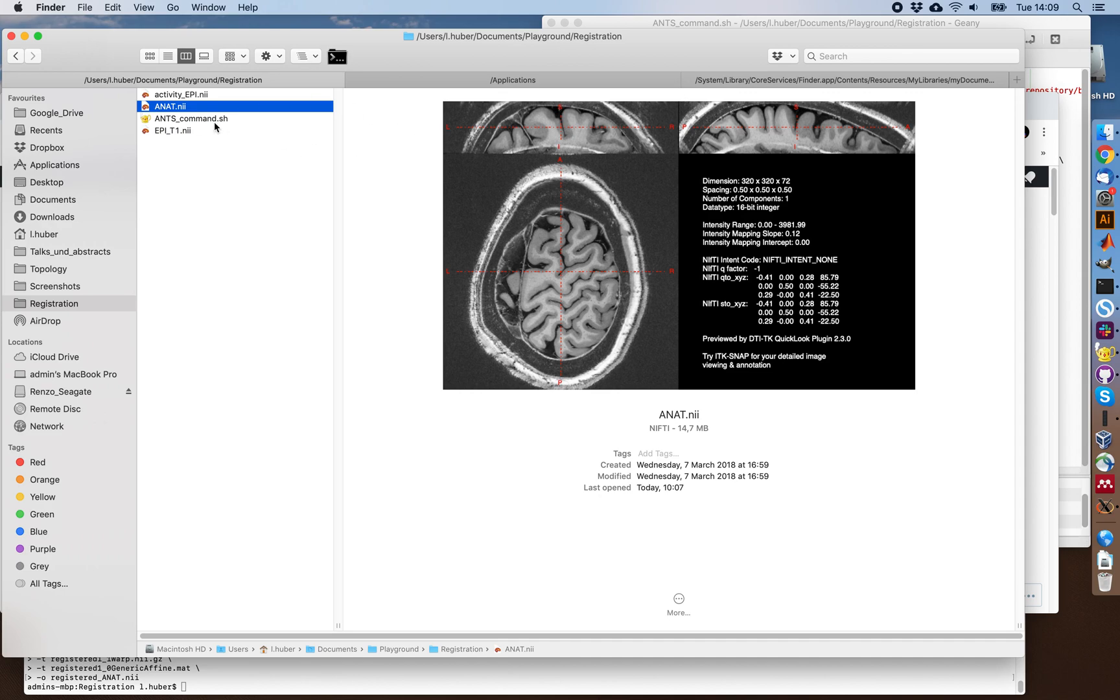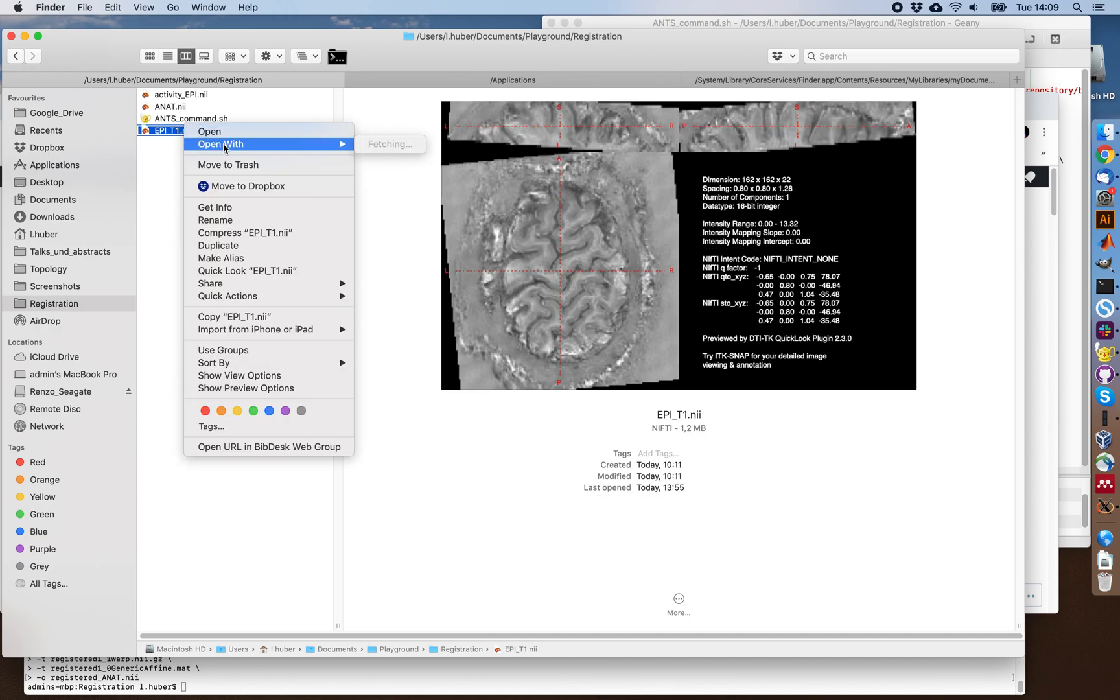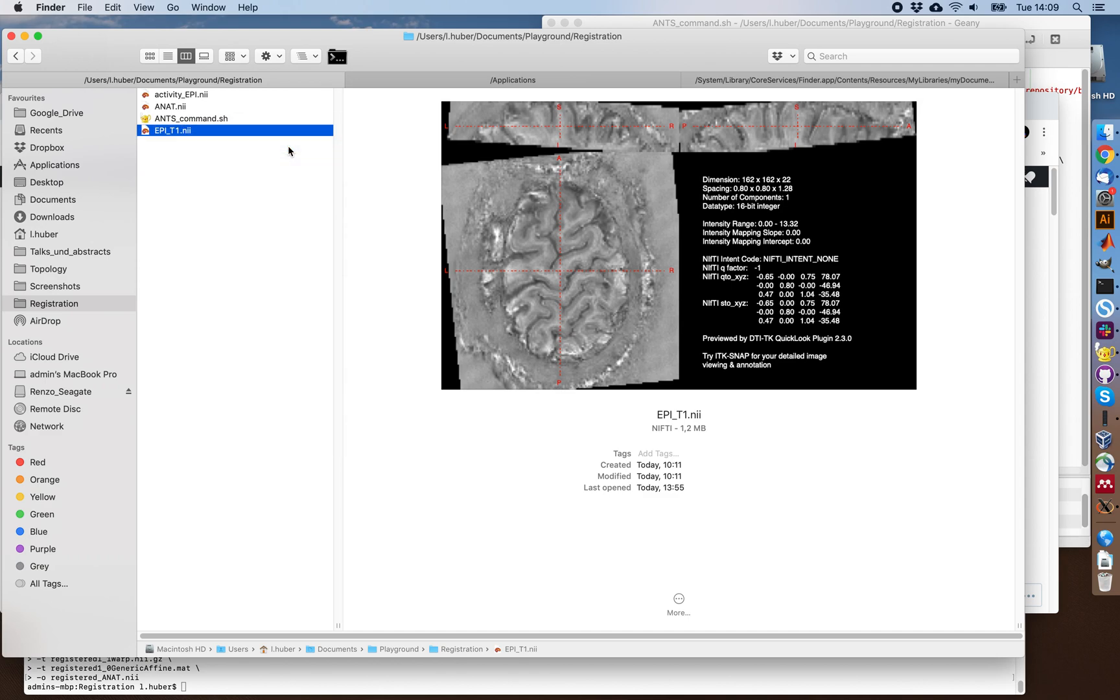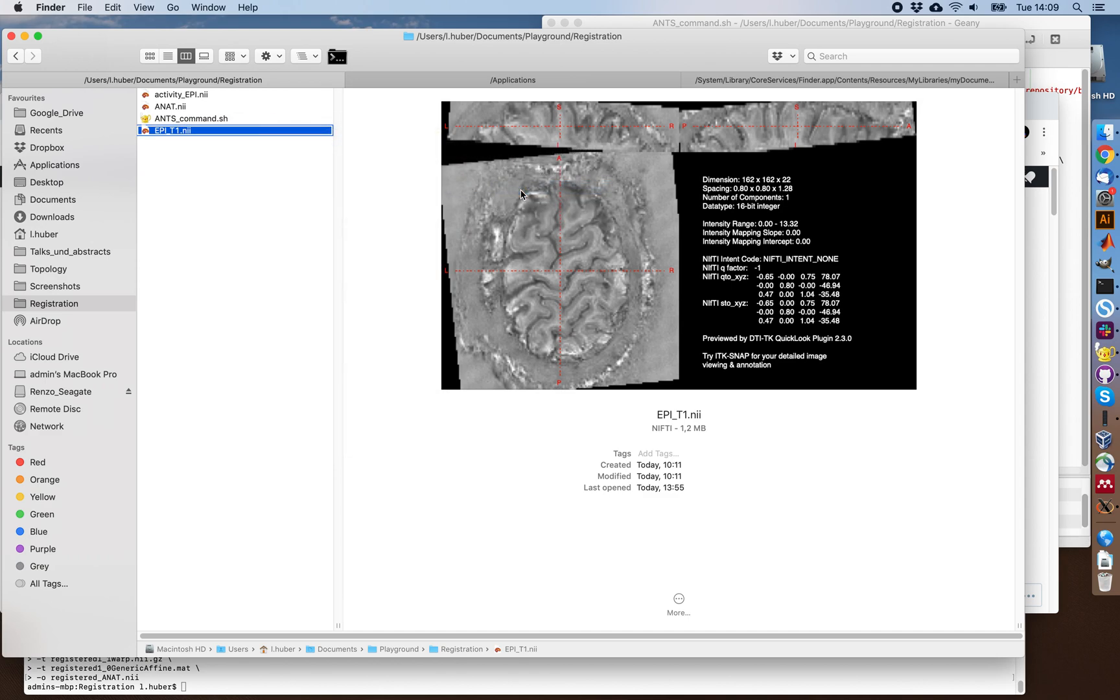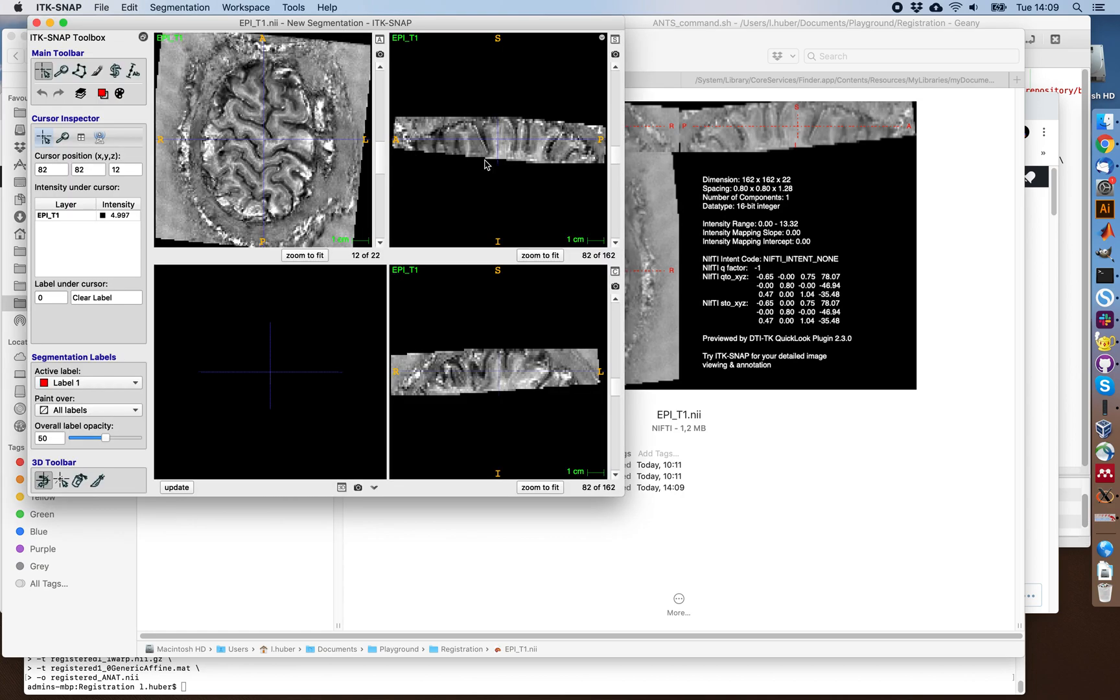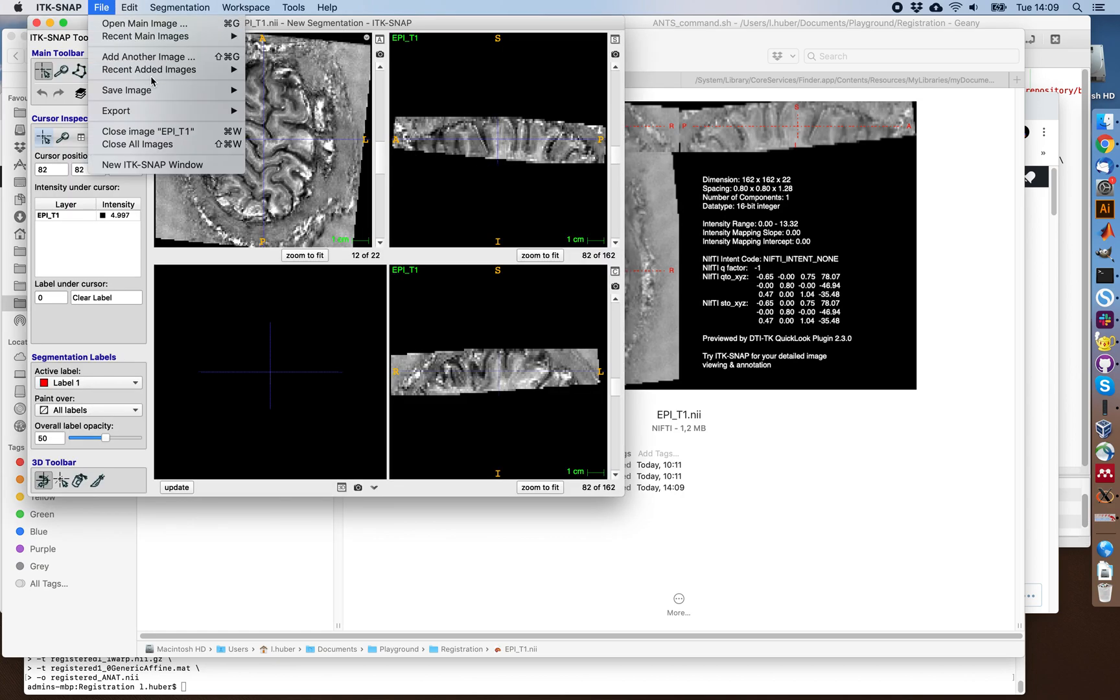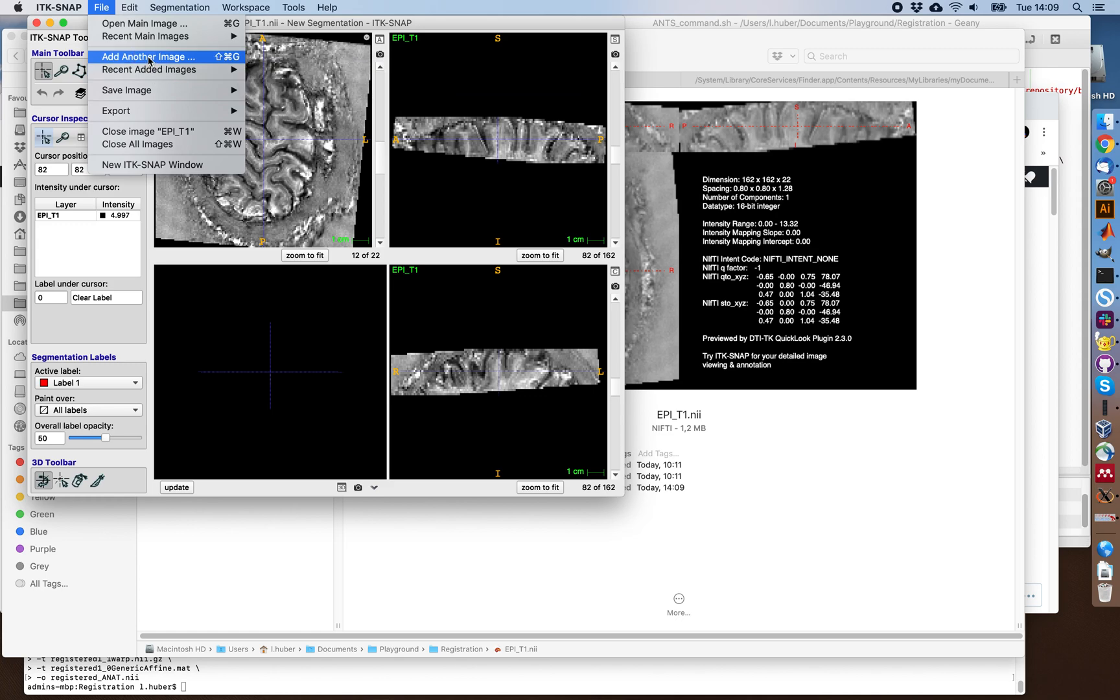So let's start by looking at those in the same space. For example, opening the EPI in high resolution in ITK-SNAP. There we go. Image in all three directions and this is already motion corrected. And then we can add another image onto it.